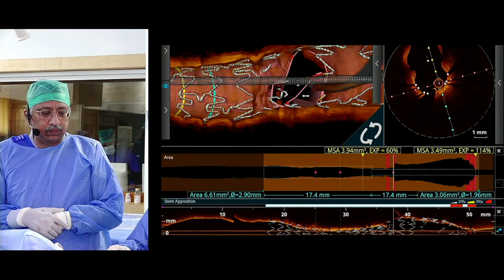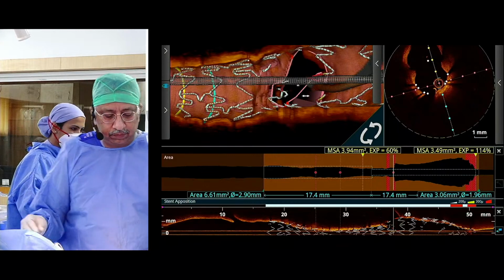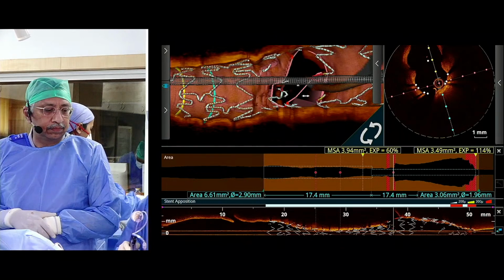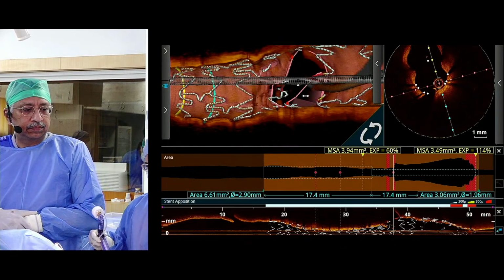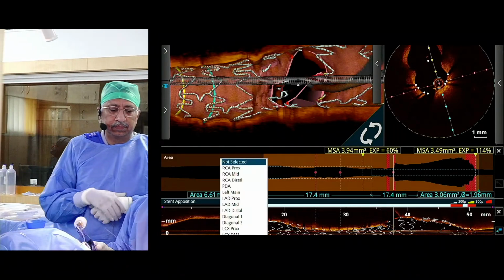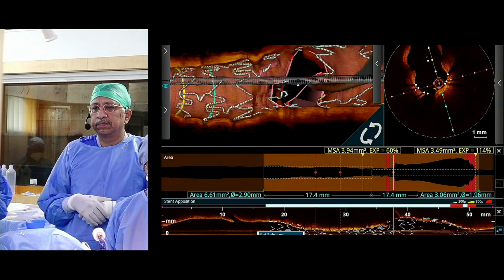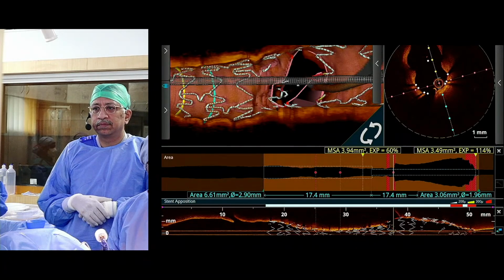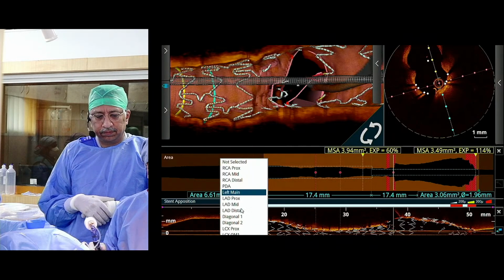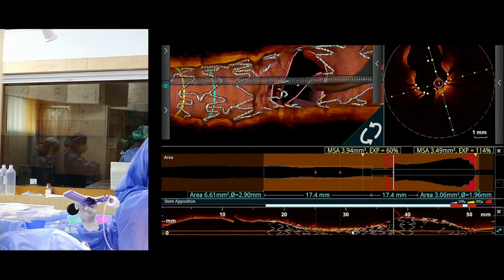So a couple of comments about the data regarding this. The OCT 3D study from Japan tested this in about 300 patients. The clinical outcomes at 1 year were not different, but there was a significant improvement in the total uncovered area, if that's the right way to describe it, of the ostium if you were going through the distal cell. And this is also being tested prospectively in the October study by Niels Holm and Evald Christensen, which is currently randomizing.